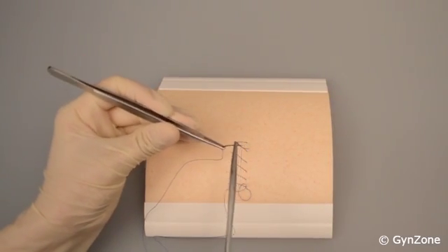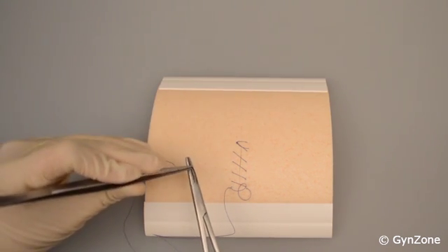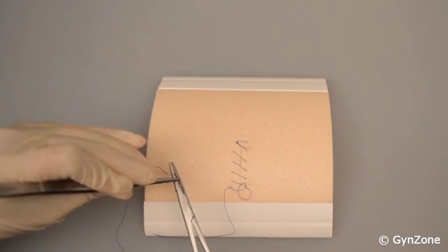If you have a lot of thread left, turn the needle tip in towards the shaft of the needle holder and fix it in this position again to avoid needle stick injuries.